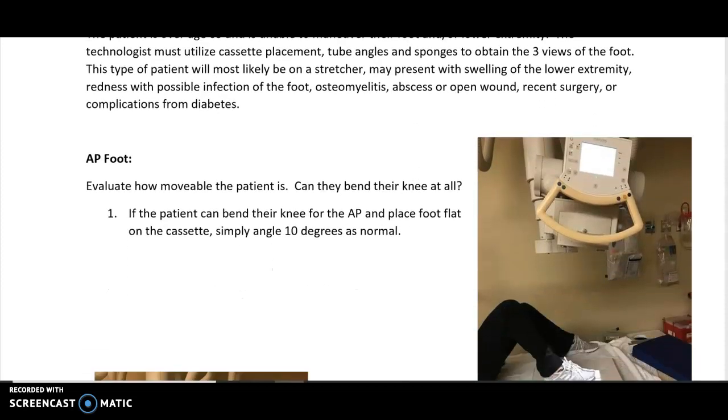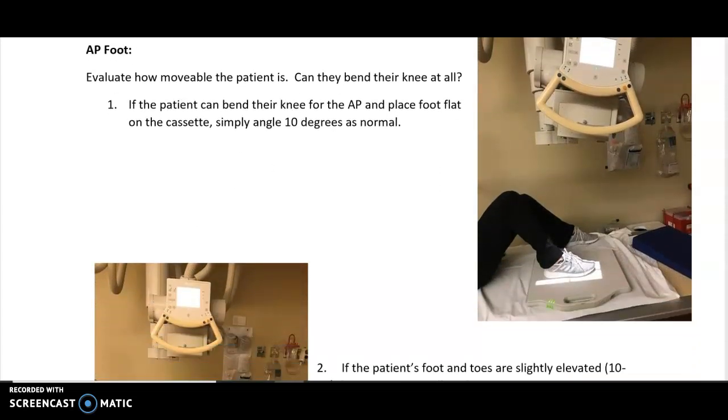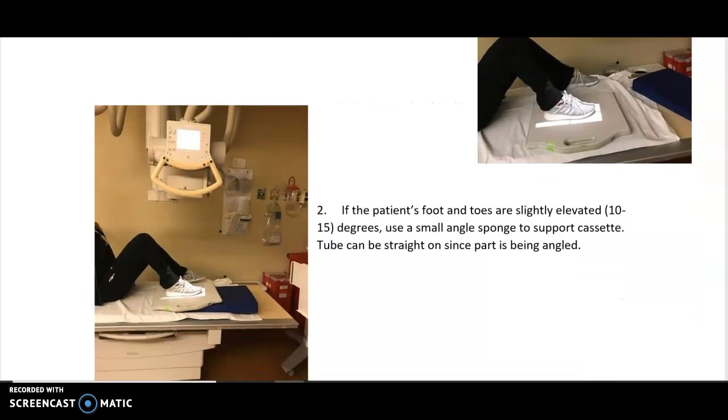For the AP foot, evaluate your patient first. How movable are they? Do you think they can do a regular foot x-ray? Can you put the cassette on the stretcher? Can they bend their knee? Do you have to angle for the AP as you normally would? If they can move, just run it like a normal foot x-ray. If they can bend their knee but their toes are still up off the board, find a small angle sponge to support underneath so the foot is flat to the board. If it's only up a small amount — around 10 to 15 degrees — you can shoot straight, since we normally angle the tube 10 to 15 degrees anyway, so you're angling the part instead of the tube.